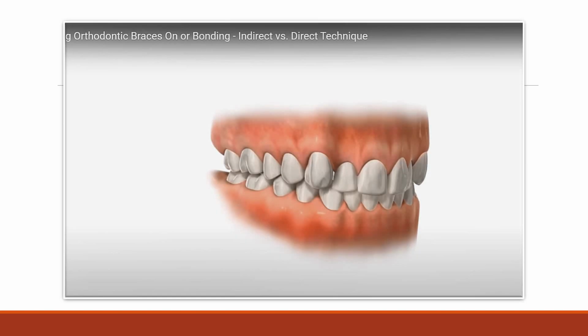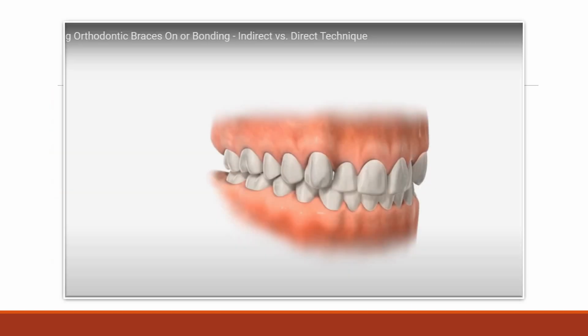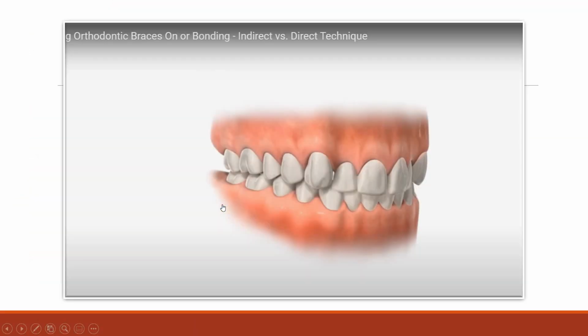Removal of appliances. Bands are removed using special pliers which exert an occlusally directed force from the gingival margin. Because of the anatomy of molar teeth, the force is applied from the palatal aspect in the maxillary arch and buccally in the mandible. In contrast to bands, the bond strength for bondable attachments must be higher to prevent repeated failures.